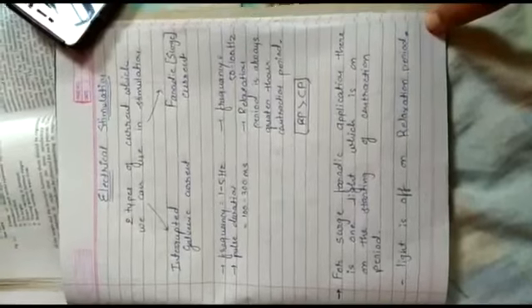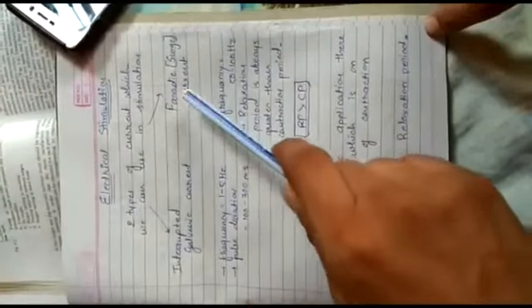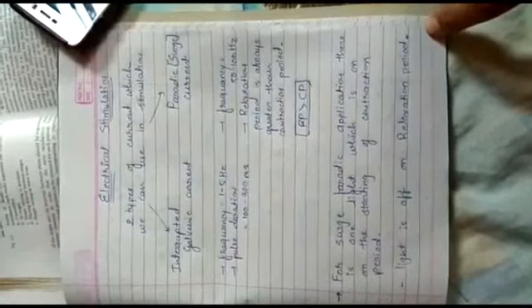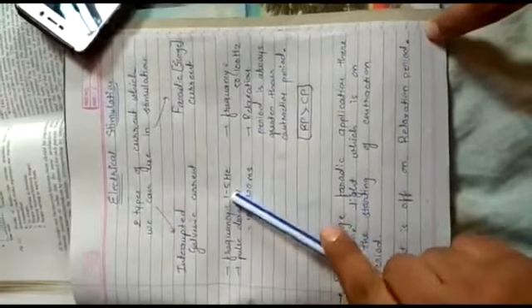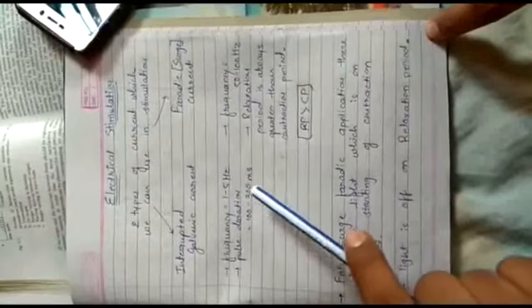In electrical stimulation, there are two types of current which we can use. First is interrupted galvanic current and second is Faradic surge current. In interrupted galvanic current, we can choose frequency and pulse duration. We can set frequency 1 to 5 Hz and pulse duration 100 to 300 milliseconds.